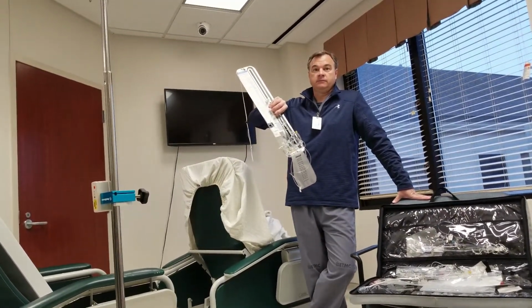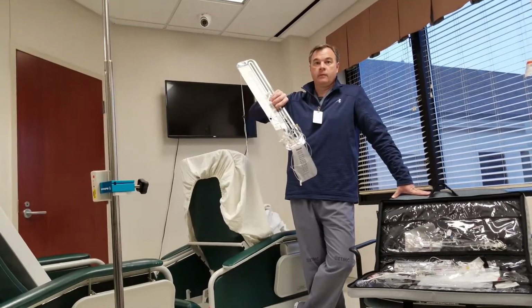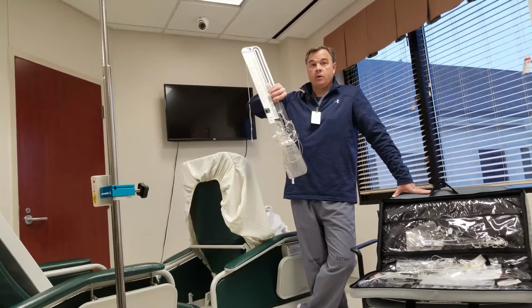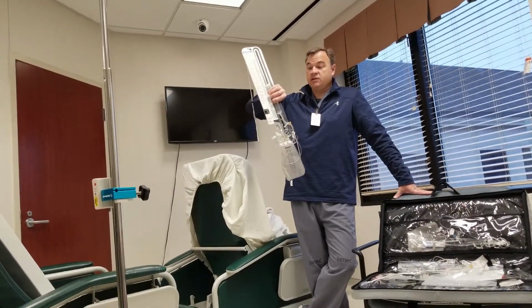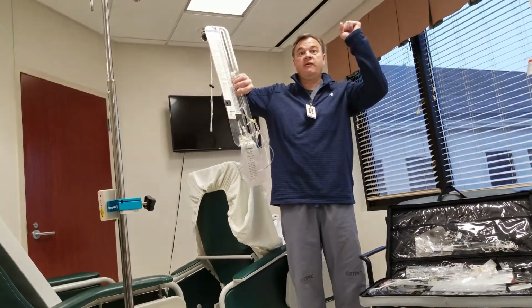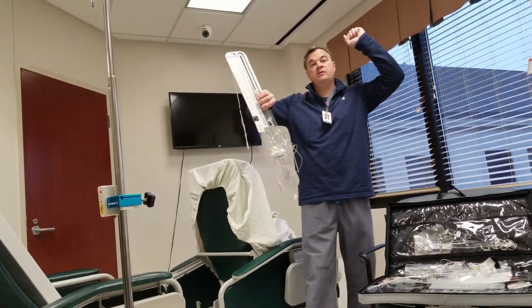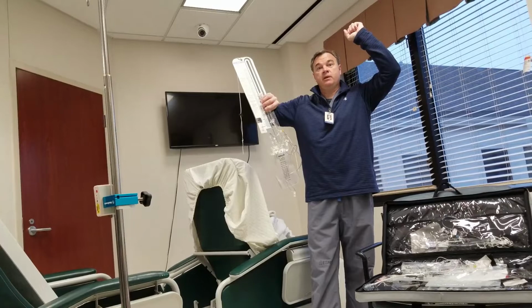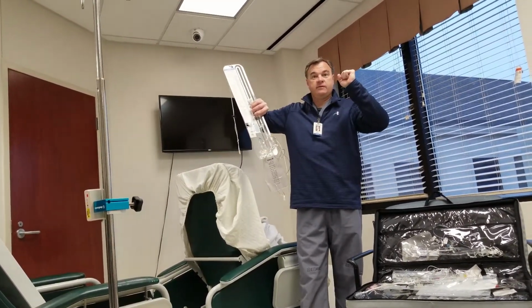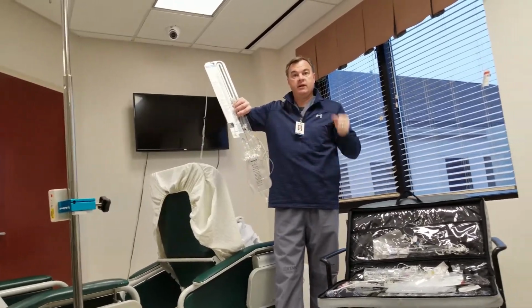So we're supposed to stay there until we get the proper volume? Typically, if it's written at a pressure, no, because it's just a real subtle drip. Gravity is creating the check valve, and just like the sprinkler analogy, when the pressure gets below that because volume has been bled off, it stops dripping. The valve's down, or gravity won't let it open.